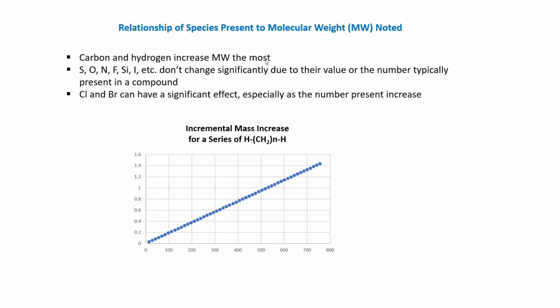So I hope this has been useful to give you an idea of how you might try to calculate molecular weight, but just be cautious and leave the error bars such that you can find what you're looking for and you don't exclude something. So I hope this video has been useful to you, and also the resource video for ChemSpider for doing these same two model compounds for comparison.